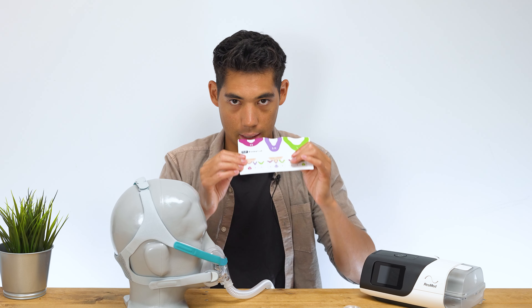At the side we have two more straps where we can address the tightness, and we have clips on the bottom that you can take off just to remove the mask every day so you're not adjusting the velcro every day. We have quite a few adjustment points with this mask. Some full face masks just have the four points on the side, but this one has that additional top strap, which is a nice added feature.